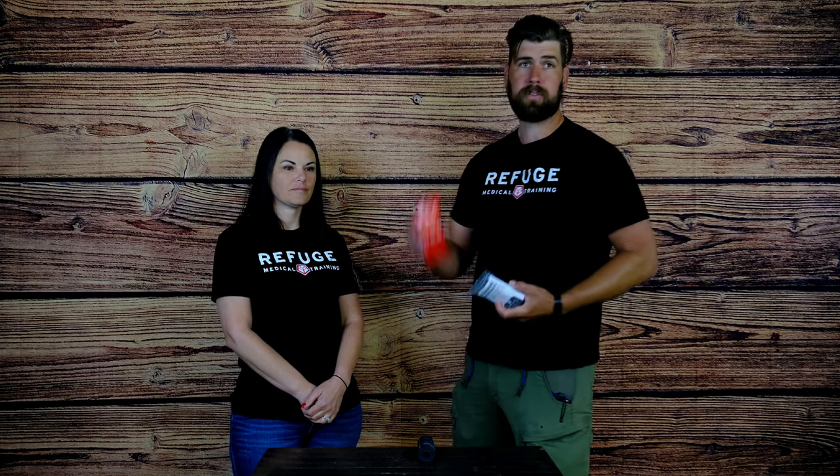Hey guys, I'm JT, and I'm Christina, and we're with Refuge Medical. Today we're going to go over a couple different products that we sell. We have the SWAT-T tourniquet and S-Mark bandage.